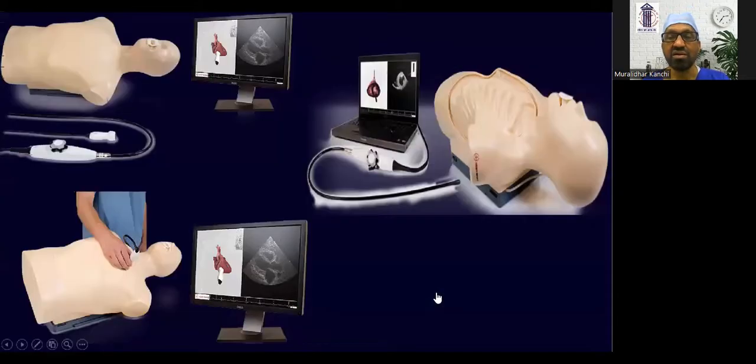Next, coming to echocardiography, here is a TEE simulator, that is a transoesophageal echocardiography simulator, that was first commercially available in the early part of this century. The cardinal feature of this system is a realistic model of the heart and great vessels that facilitates easy insertion. This high fidelity model was developed using state-of-the-art animation technology, and its use has been made possible by advances in graphics processing units, which can be used in personal computers.